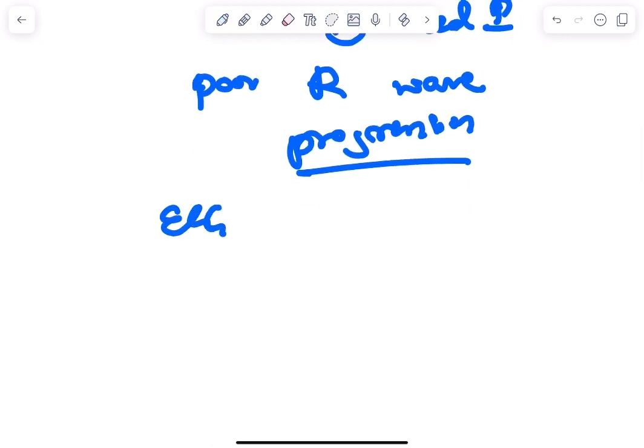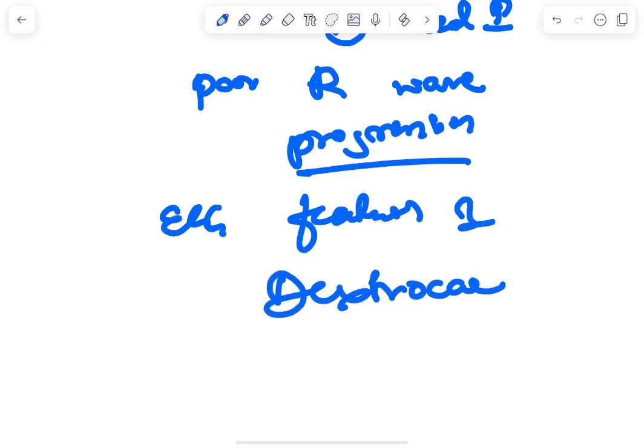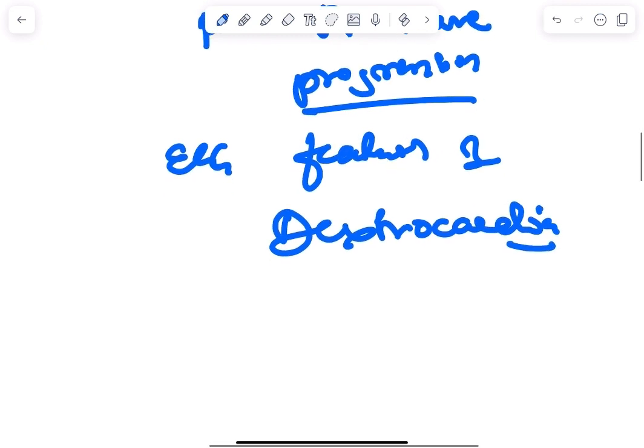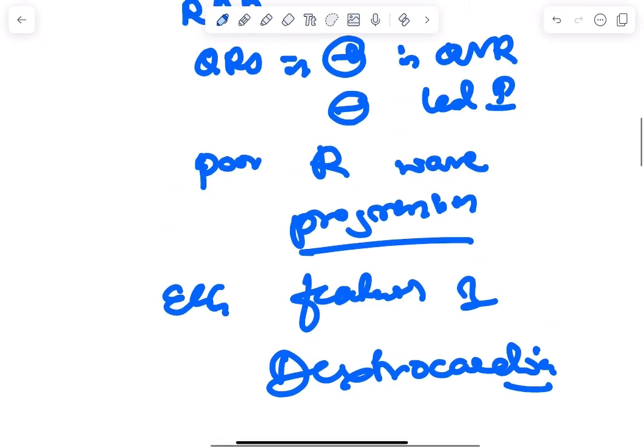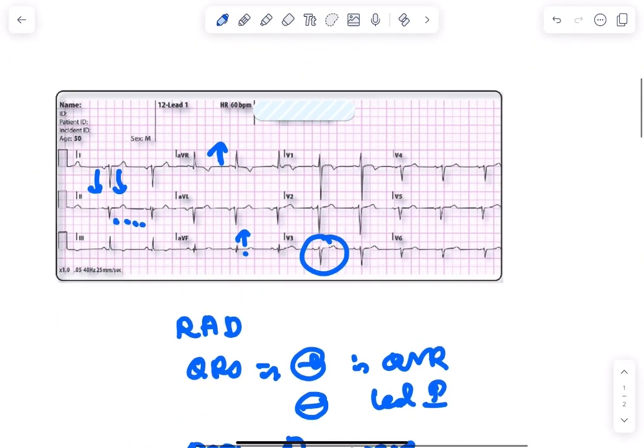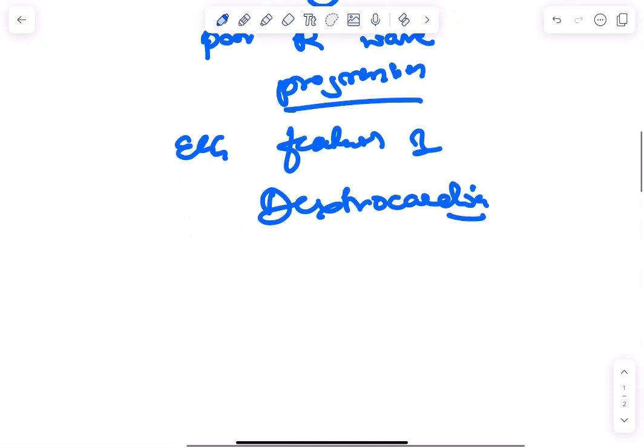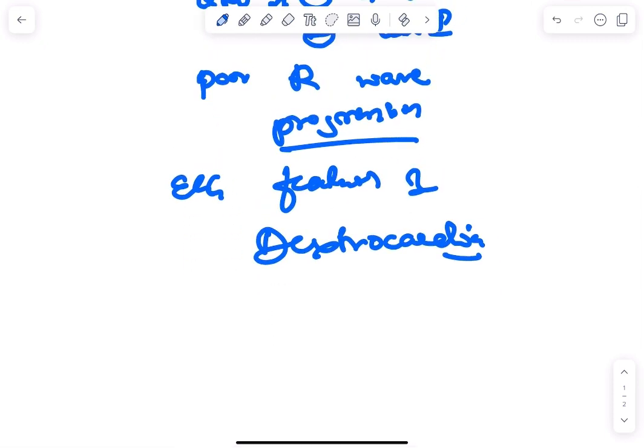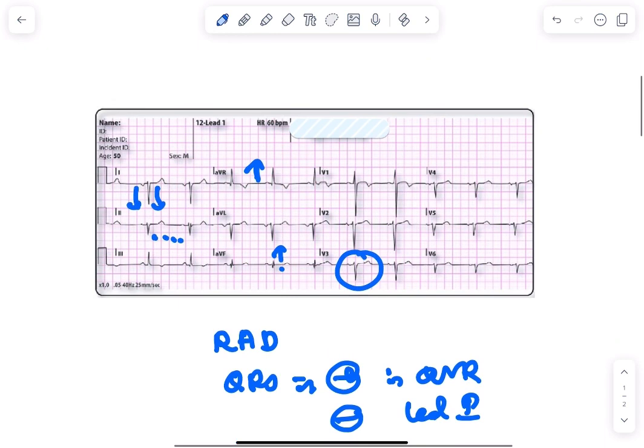One of the important syndromes where dextrocardia is seen is Kartagener's syndrome. So sometimes there may be a question: a young male with copious sputum production and the ECG is shown here. So you can say the ECG is showing dextrocardia and the copious sputum means it could be a case of Kartagener's syndrome.